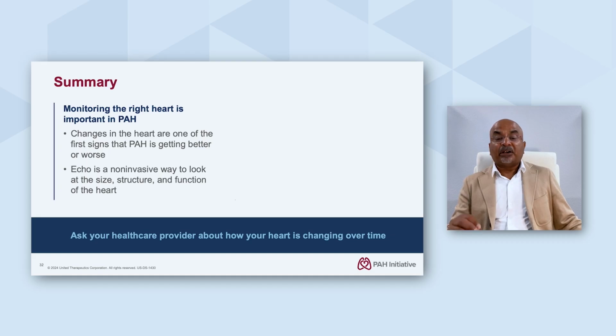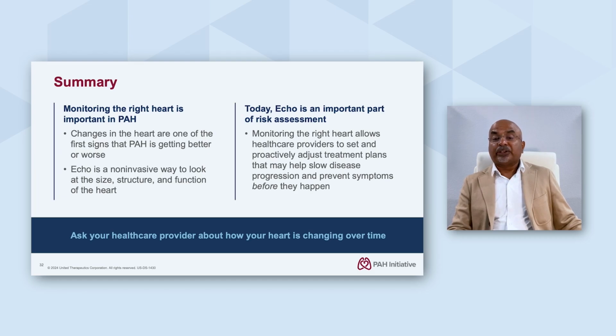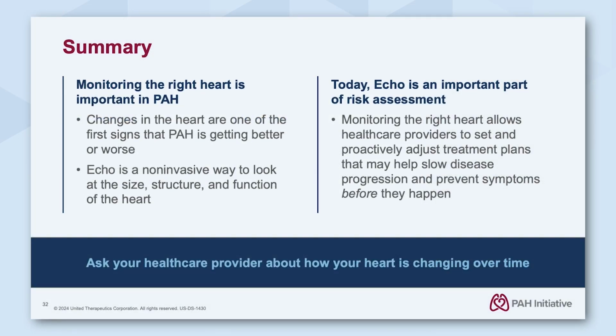Echocardiogram is a non-invasive way to look at the size, structure, and function of the heart. Today, echo is an important part of risk assessment, as we spoke about a couple of slides ago. Monitoring the right heart allows healthcare providers to set and proactively adjust treatment plans that may help slow disease progression and prevent symptoms before they happen. Please ask your healthcare provider about how your heart is changing over time.